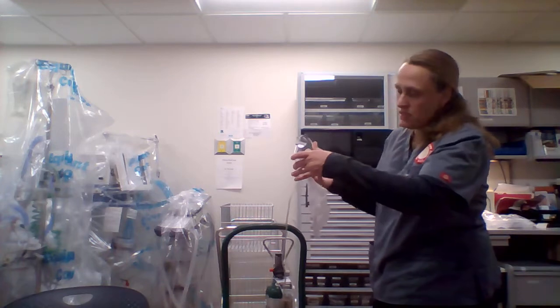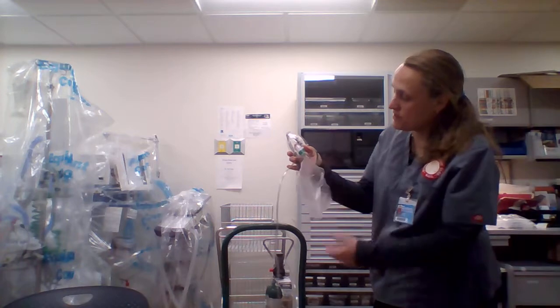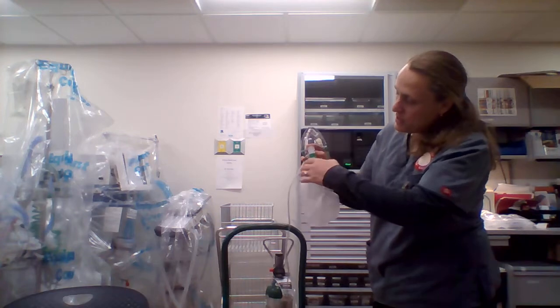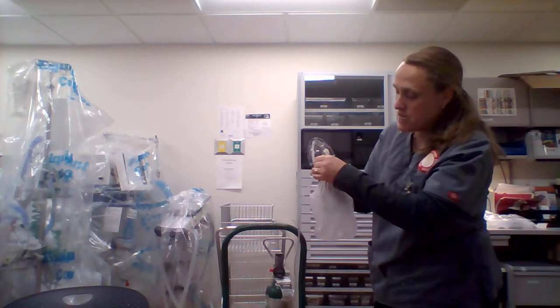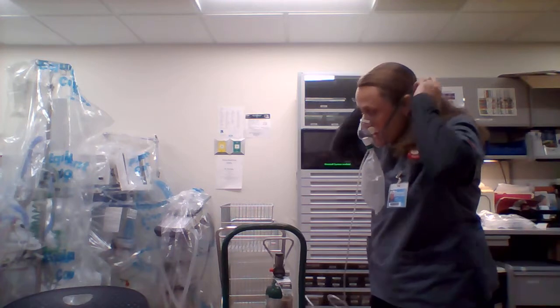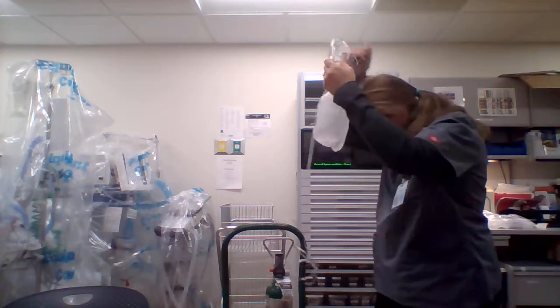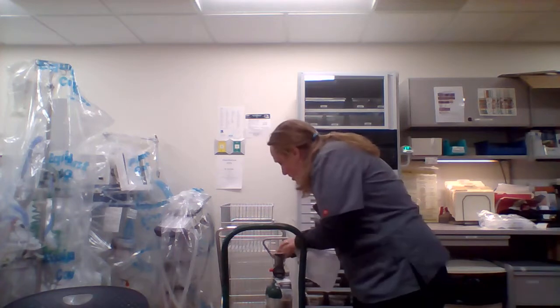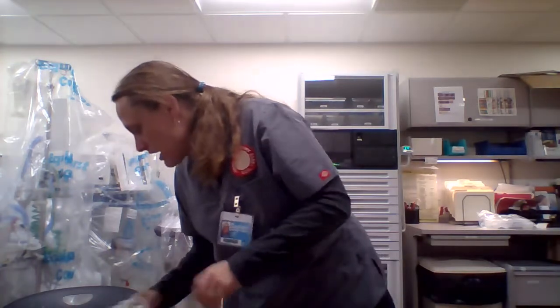Bag should inflate. It's not wanting to. So I'm going to cheat. Put my finger over that little valve. Okay, 2 fingers over the valve. And get that to inflate. Because if it's not inflated, it kind of acts like a paper bag. You just keep rebreathing CO2. And it goes like that. And you tighten it up a little bit right here for patient comfort. Put it on the nose. Super handy because it's useful for adults, pediatrics, and infants. It comes in all sizes. So does the simple mask and the cannula.